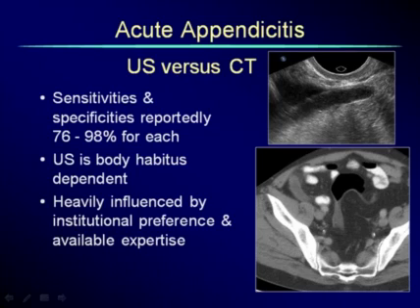Ultrasound is limited by a number of factors. We all know about bone and gas, etc., but it's probably best decided by the body habitus of the patient. So if it's a thin young patient, it should do quite well. In an obese, heavier patient, it does not do very well at all. Those should go to CT.